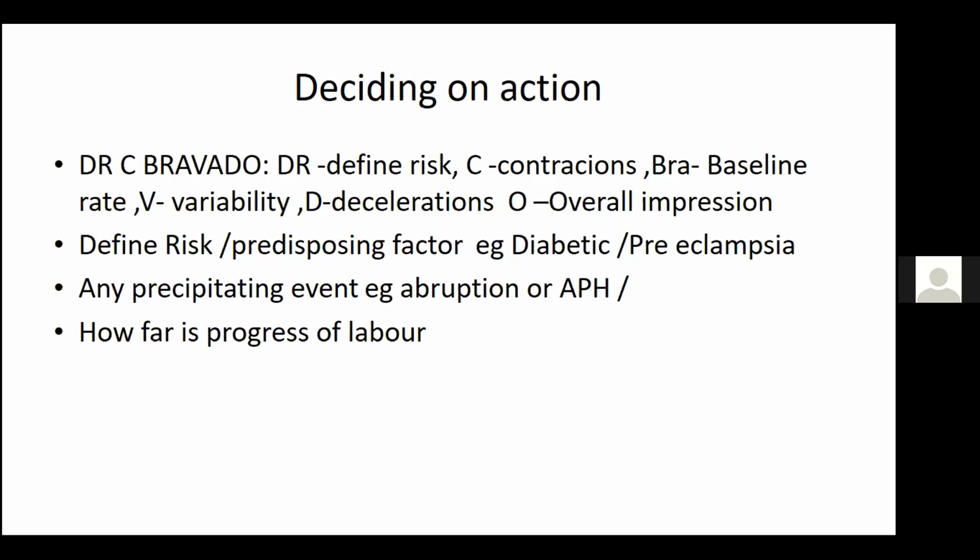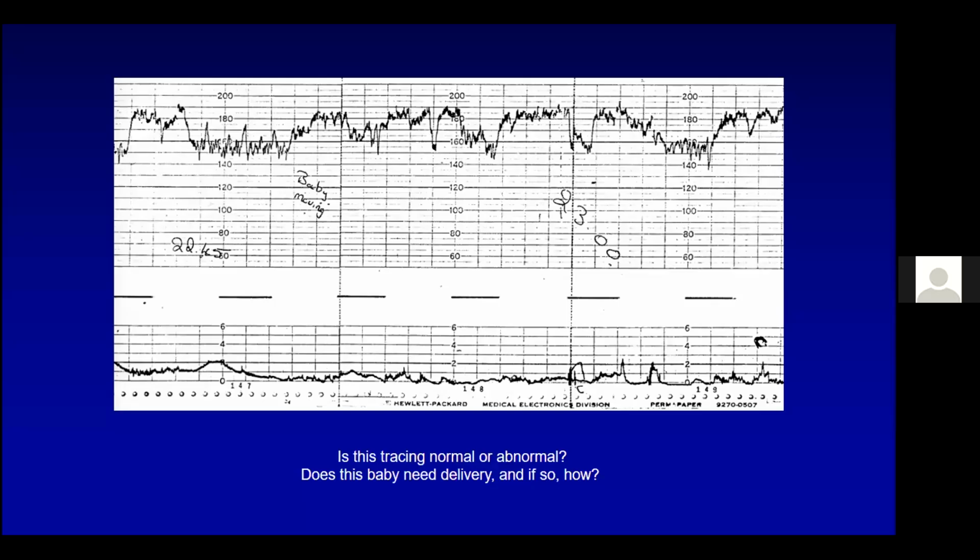But in someone who's 8 centimeters, they could deliver even within the 2 hours and rupture the membranes, and you try to make things go quicker. Therefore, the progress is already advanced, and the likelihood that she's going to deliver within the 2 hours before you're reviewing a suspicious CTG is actually very important.